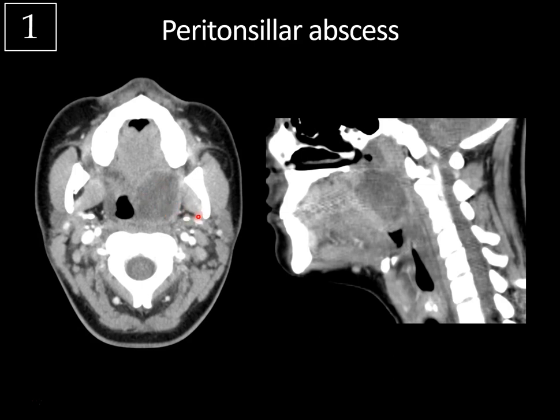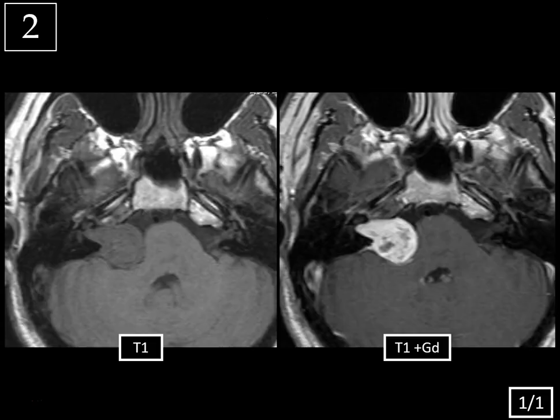This is a good triangle of fat to look for as part of your search pattern when looking at a CT neck or CT cervical spine. If you have a mass or abnormality in the masticator space, the carotid space, the retropharyngeal space, or the pharyngeal mucosal space, those will all efface the fat pad in different patterns.